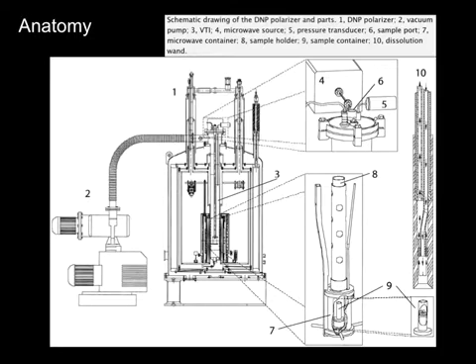It's called the W band of microwaves. It's something like what you might use if you were going to build a Death Star or something. You wouldn't really ever use this for something practical. Even radar is lower in general frequency than this. So it's basically restricted to military applications.